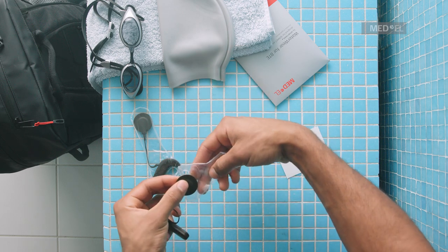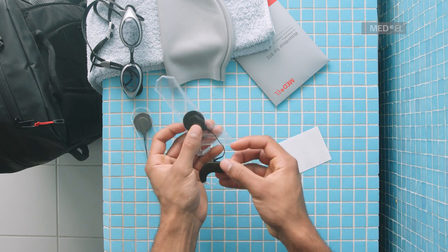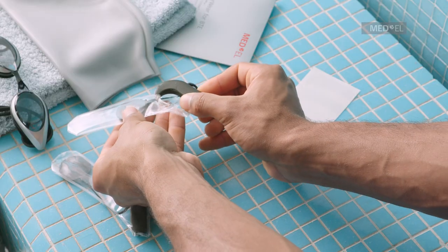Carefully insert the coil into the Waterwear sleeve. Hold the battery pack between your thumb and forefingers and insert the earhook, then turn it until it reaches the end of the cover.